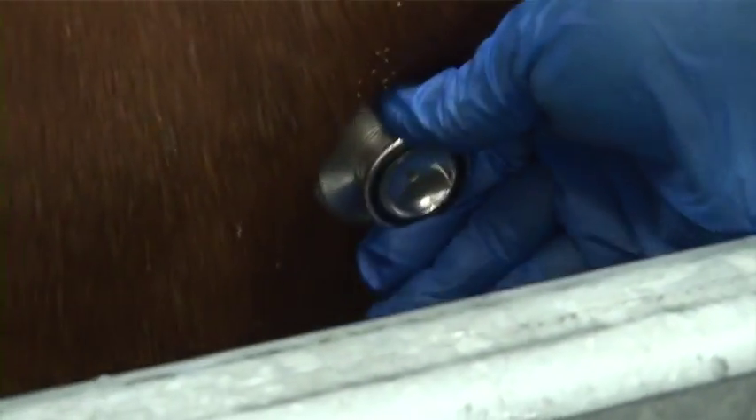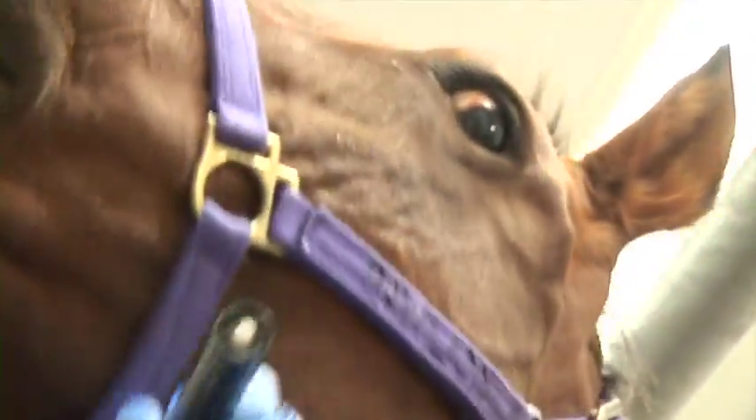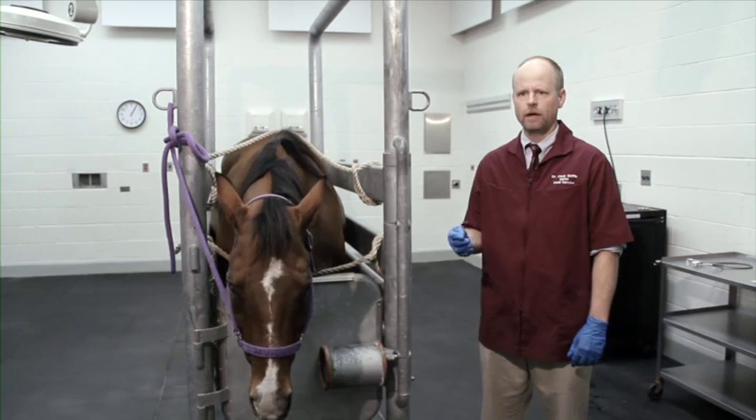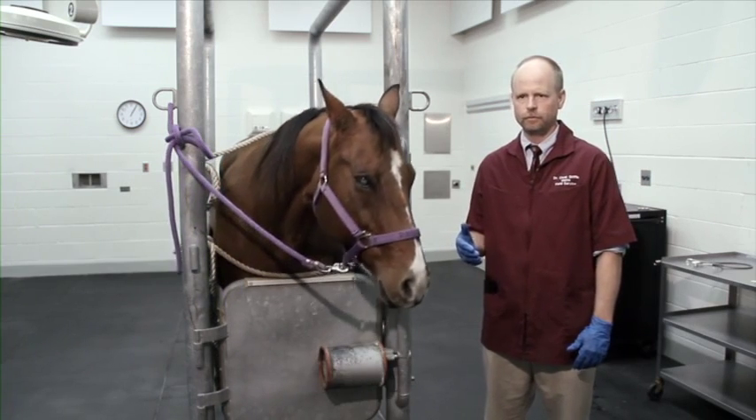Once the physical examination is completed, the next step is to obtain a preliminary look into the mouth. With an unsedated horse, this is done by gently retracting the lip and cheek with a small light source. Horses have a threshold of fear, anxiety, or discomfort that will be tolerated, and once that threshold is exceeded, a flight response may be initiated — a very sudden, violent attempt by the horse to leave the situation — which can seriously injure the horse or bystanders.